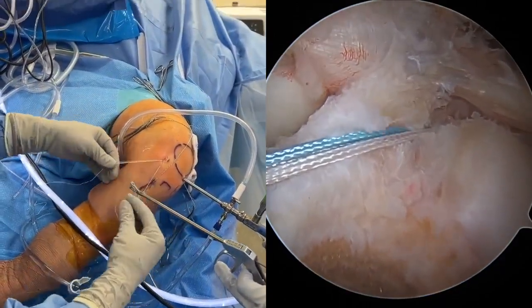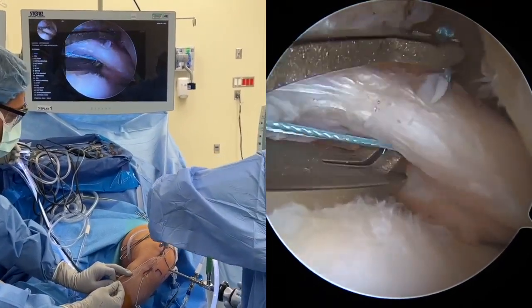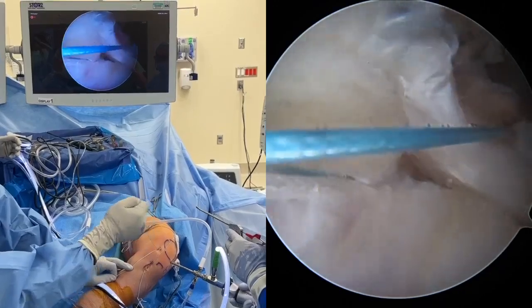The blue repair suture is loaded into a knee-scorpion suture passer. Using the inferior medial portal, the blue repair suture is passed through the meniscal root tissue and shuttled back through the inferior medial portal.